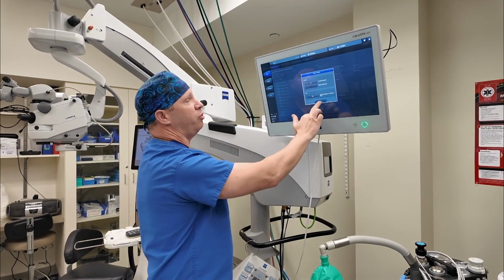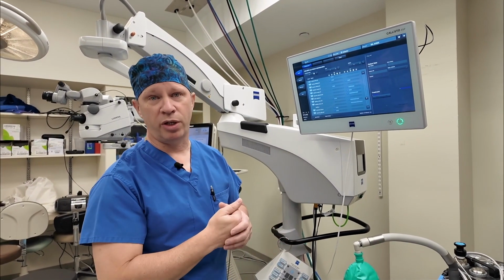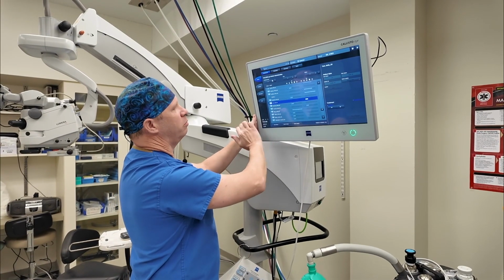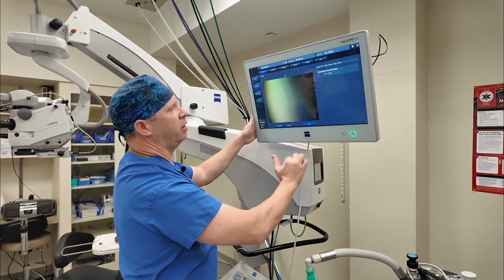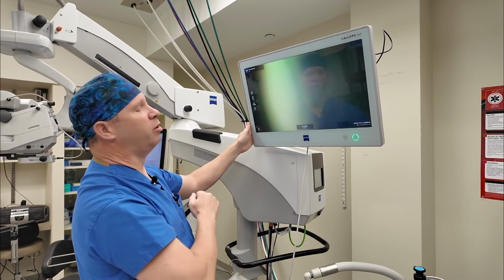So this is going to bring the new information over to Callisto so that we have all the proper markings that we need for the toric IOL. So here's our new data. We'll bring that patient in. And now the new toric IOL will show up on our screen.